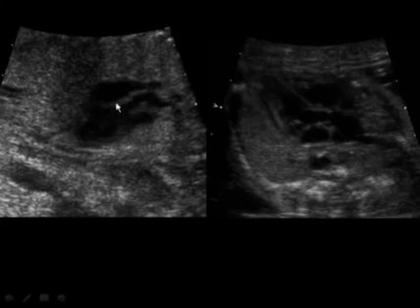The issue is that the superior and inferior walls of the aorta are normal even when there's an overriding aorta. It's the medial wall of the aorta that we care about, and you can't see the medial wall of the aorta when you take an image in this plane. So the medial wall of the aorta is in here somewhere. So the better technique for taking an image of the aorta is to stick on the four-chamber view, stay with the axial plane, and follow the interventricular septum up so you see that medial wall of the ascending aorta.